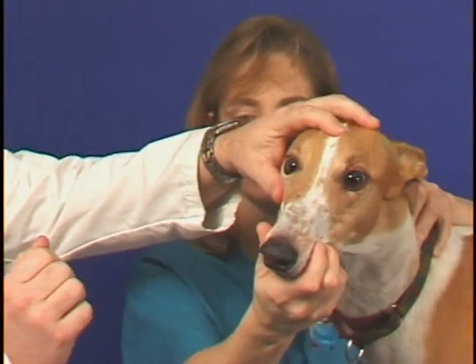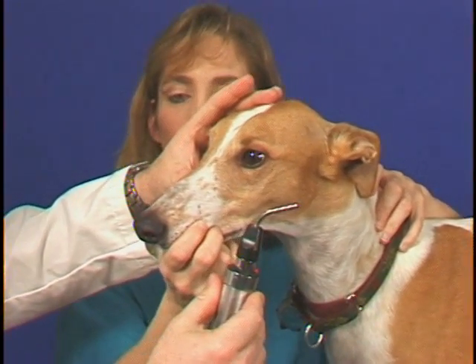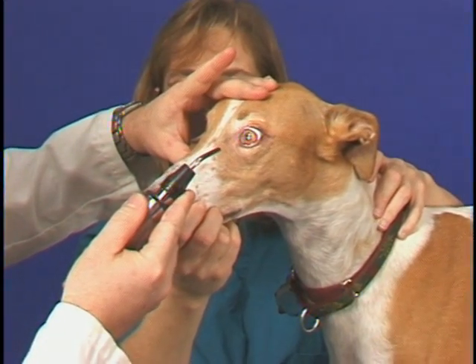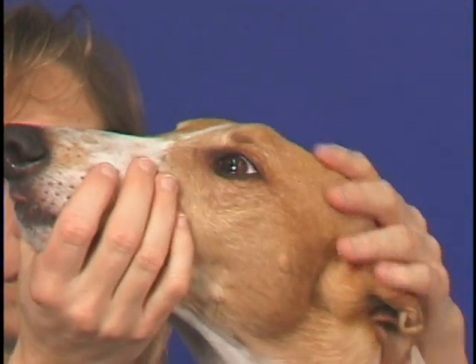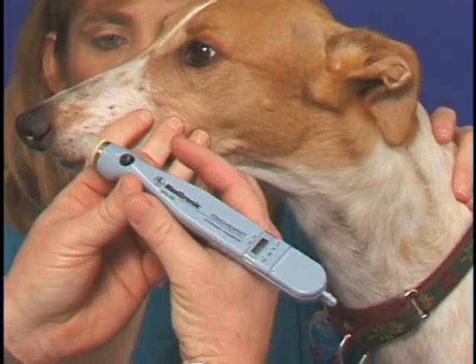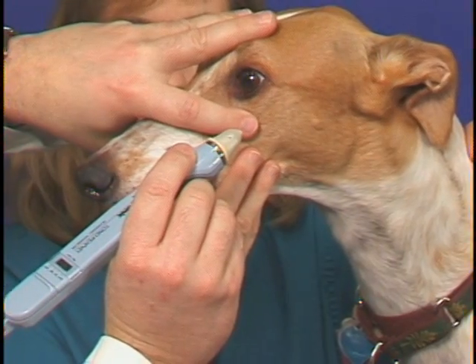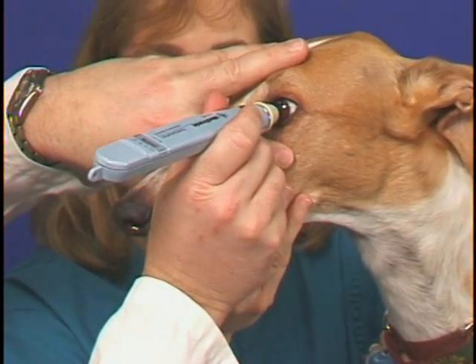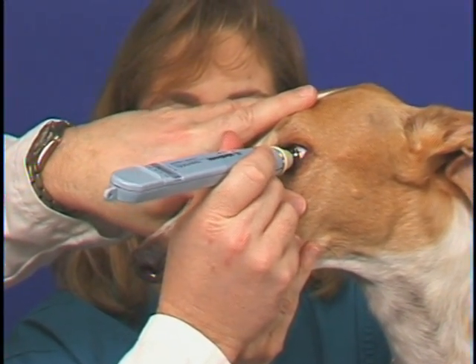In addition, given the predisposition of primary glaucoma to become bilateral, the second at-risk eye can be monitored every 2 to 3 months, resulting in early detection and prompt referral for medical and surgical intervention. Together, the general practitioner and the veterinary ophthalmologist can manage these patients better and maintain vision longer than was the case prior to the availability of the Tono-Pen.